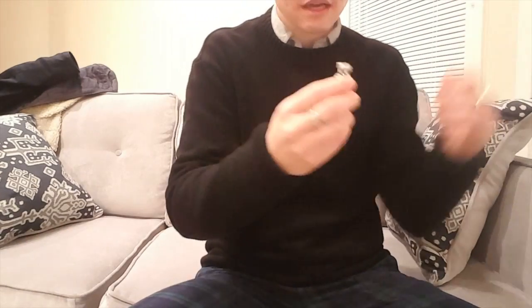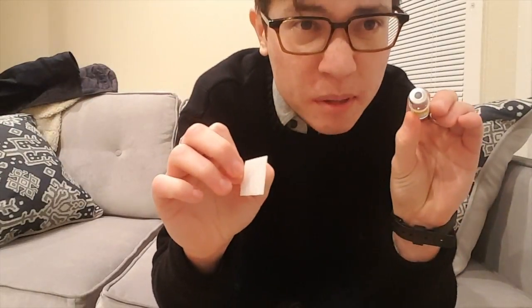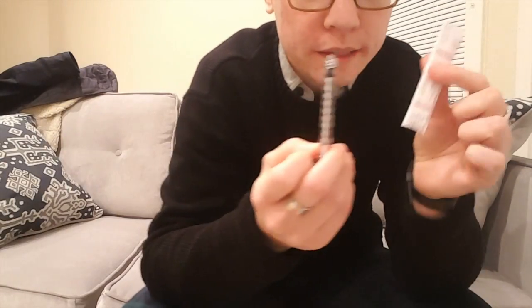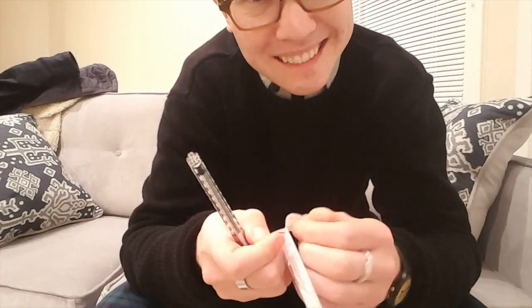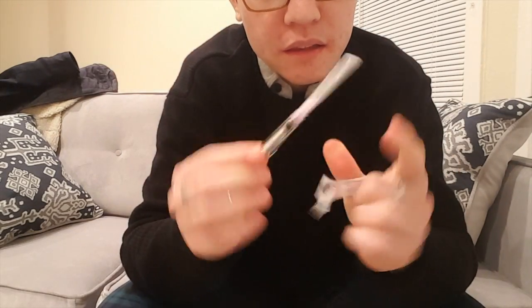So this guy is now warm. Going to clean it off. Like I said, one of these. Top of this guy. Now I'm going to get the syringe ready to draw up. Get my syringe and the big needle. It just spins right on there like that. This is the cover.